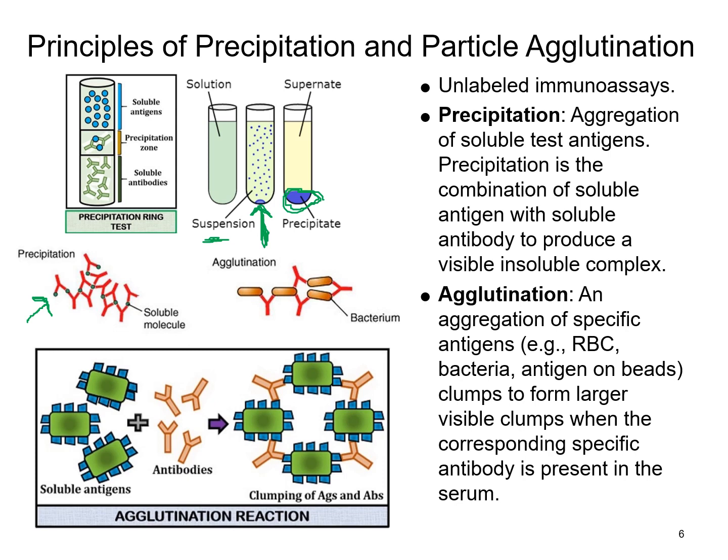Now with agglutination, you have those antibodies, and then you have those red cells that are present. So you actually can visually see those red cells, but they're dispersed throughout that solution. But once you have that binding actually start to take place, then you're going to actually get clumps of cells that will be more visual. You can see that clumping actually taking place with those cells forming those clumps. And that can also take place if you're doing a test that's specifically looking for bacteria or anything like that. You can also have that same agglutination take place.